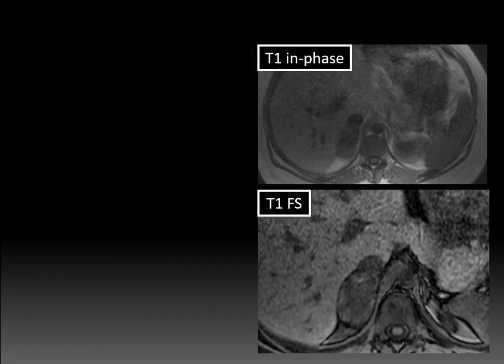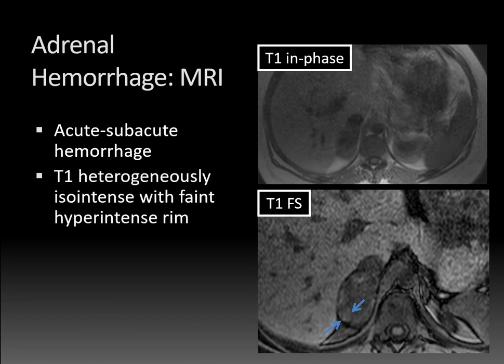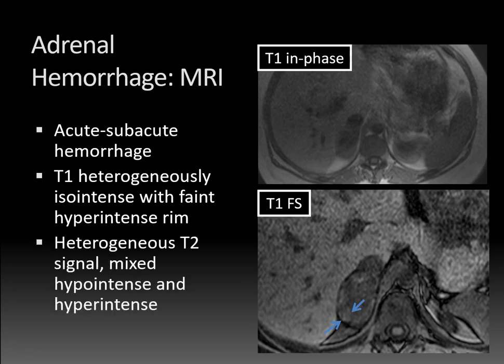Looking at the T1 fat-suppressed image, there is a faintly hyperintense rim on T1 images. Given the T2 signal, this is consistent with acute to subacute adrenal hemorrhage, which goes along with the patient's fairly acute presentation. The T1 heterogeneous isointense appearance with a faint hyperintense rim and heterogeneous mixed signal — the darker the T2, the more acute the hemorrhage.